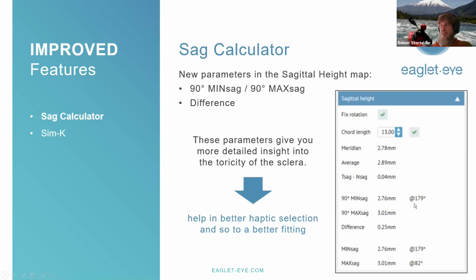There it is showing the flattest meridian angle. The other place where you can check it is within the first lens fit algorithms. On top of the lens prediction itself, we also have fit axis.